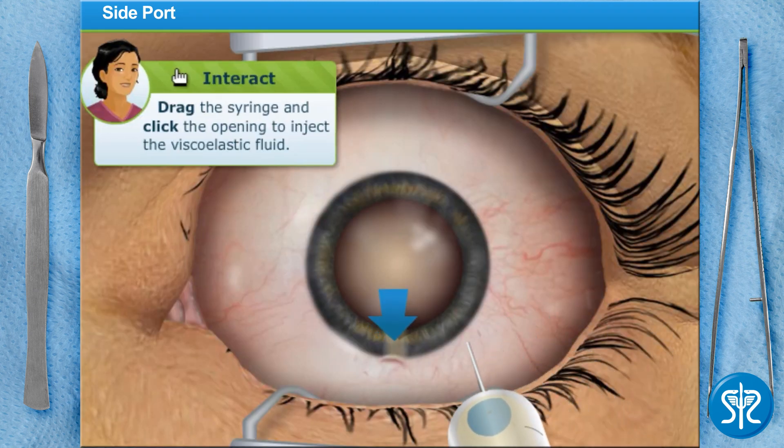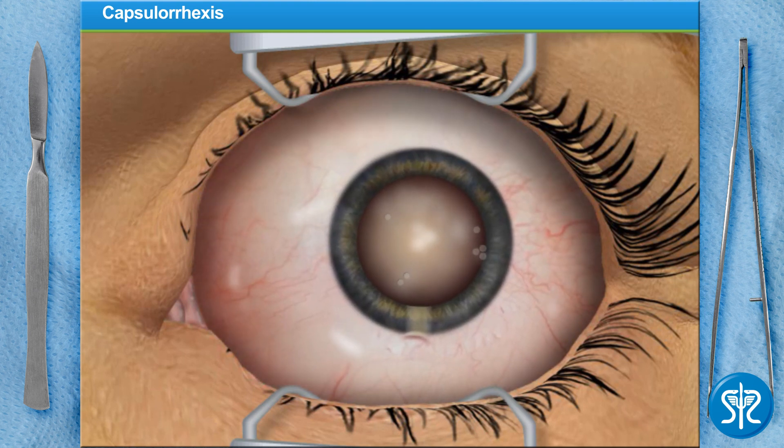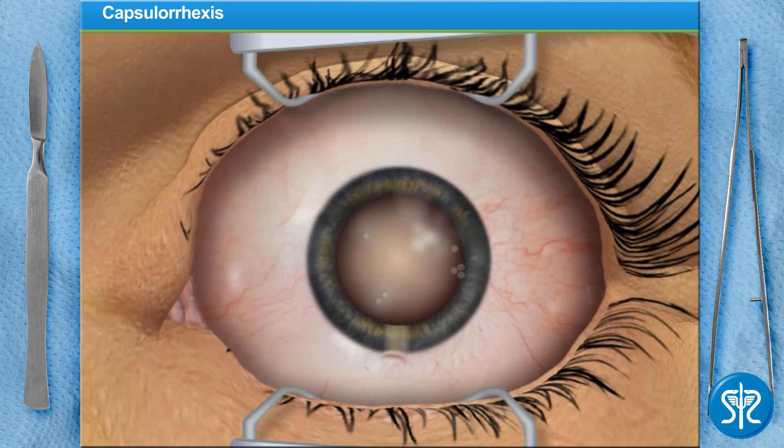Help me out and inject the fluid into our patient's eye. Now we need to make a 2.85 mm wide incision at the edge of the cornea for the cataract removal. This is done with an extremely thin diamond scalpel.